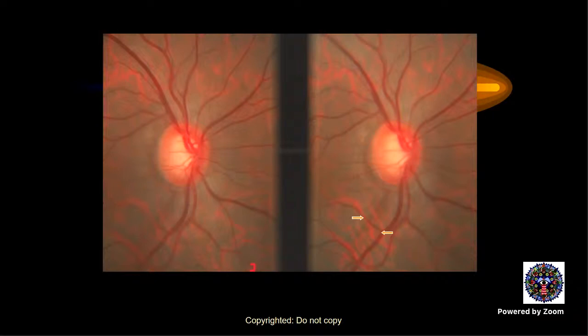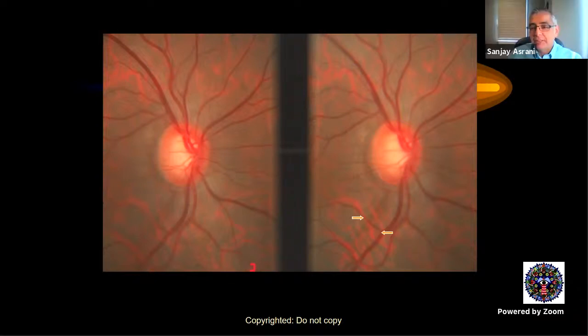Thank you. So, Vanita, I have stopped doing it myself. So I'm going to ask you to go ahead and describe it to them. But I want them to really learn how to identify it in a live patient. And you can see that when you have a dilated examination and a 78 diopter lens, and you're looking at each clock hour around the optic nerve. Then you can see this in 3D.